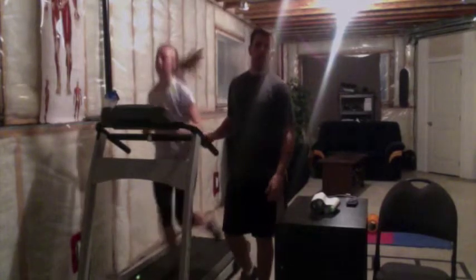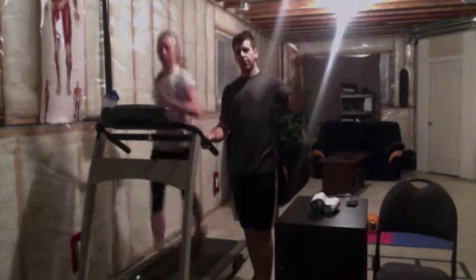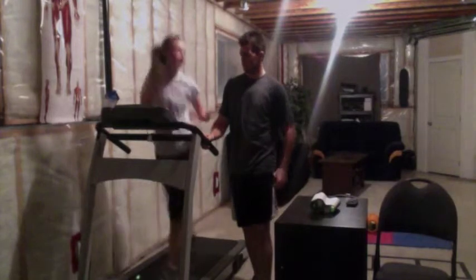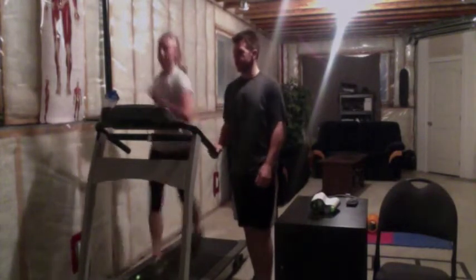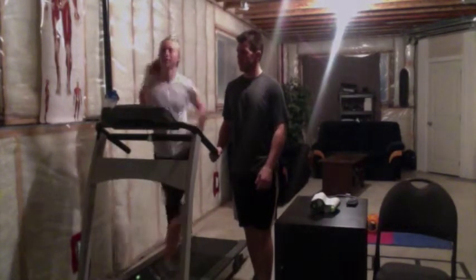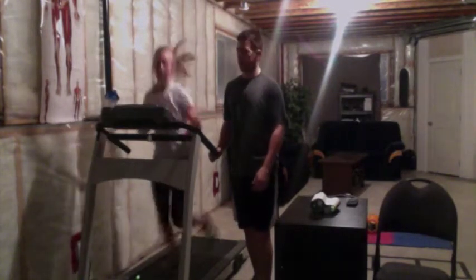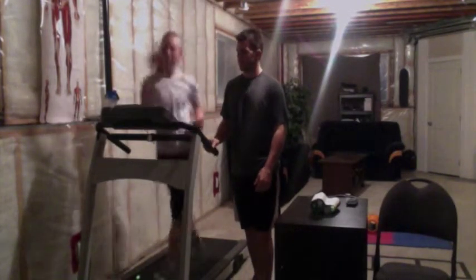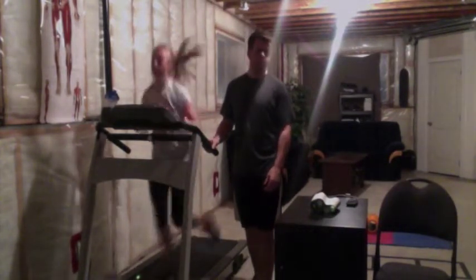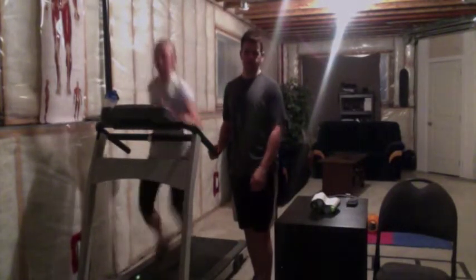Okay, so we've bypassed quite a few of our sets here. This is the last above AT interval for Kaylee. She's coming up on just the 24th minute mark of her interval training. So once we're done this, we're gonna have a nice cool down. We're gonna slowly decrease her heart rate, get it below 100 BPM, and then we're gonna sit Kaylee back down and make sure that our blood pressure is back close to baseline, and her heart rate.